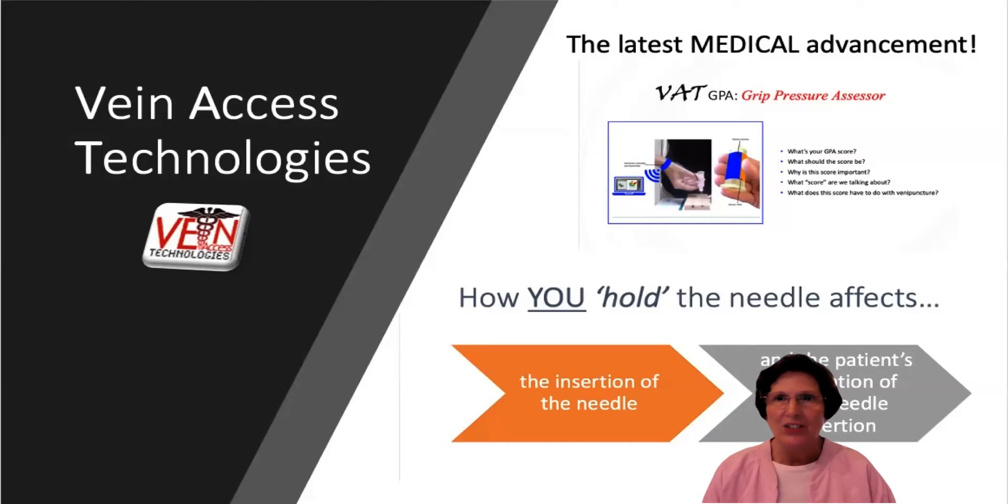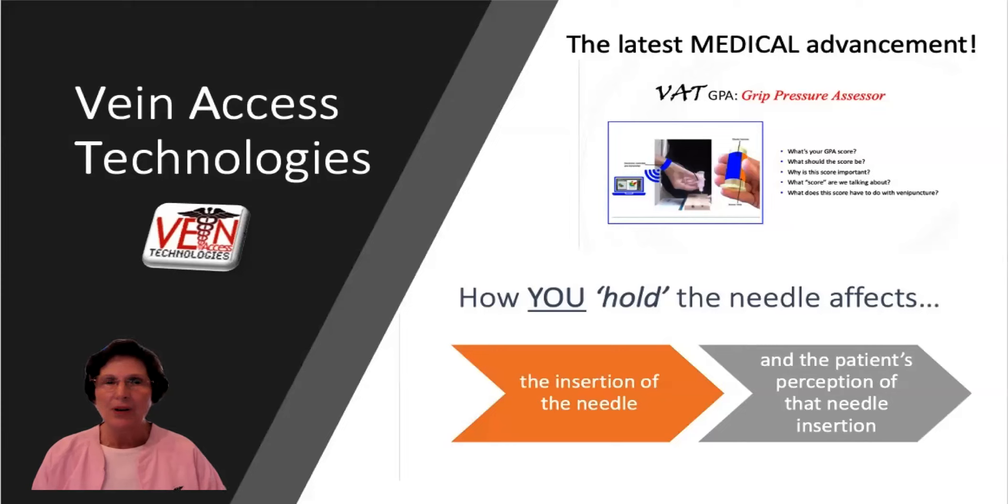So this Grip Pressure Assessor is the latest medical advancement in venipuncture. You have sensors on the adapter sending signals to the receiver, sending signals to the computer, which tells us what the pressures are. This tool and this concept of measuring grip pressure is the latest medical advancement in venipuncture.